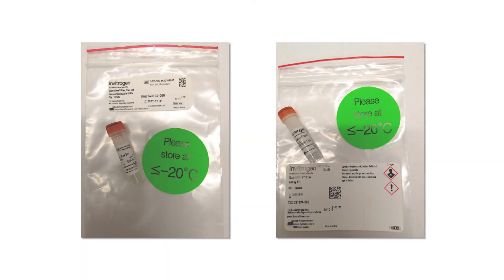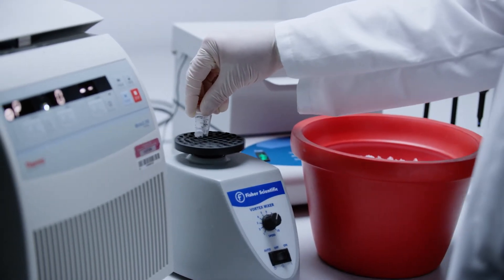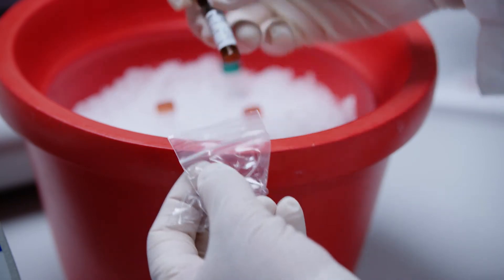Prepare the day one reagents by removing the probe set and blocking reagent from the freezer and thawing them on ice. Vortex and centrifuge briefly and then store on ice. Place the proteinase K tube and capture beads on ice with all other reagents until use.